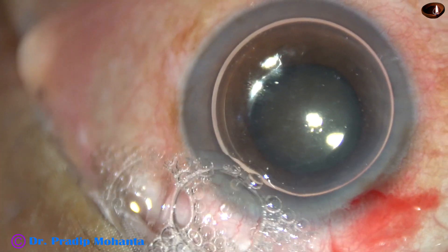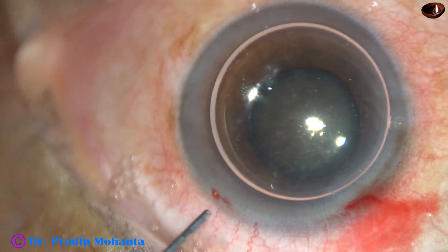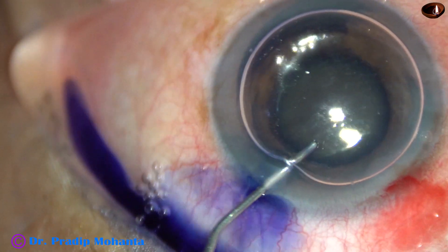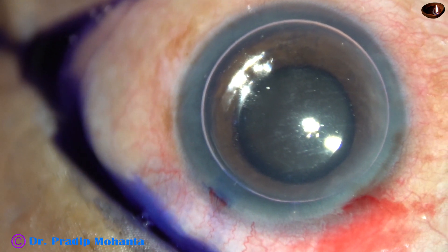This is an air bubble. Underneath this air bubble, trypan blue dye is injected over the anterior capsule uniformly on all areas.